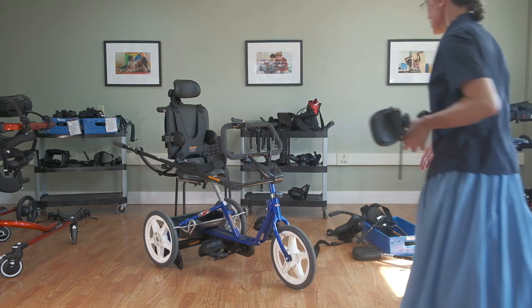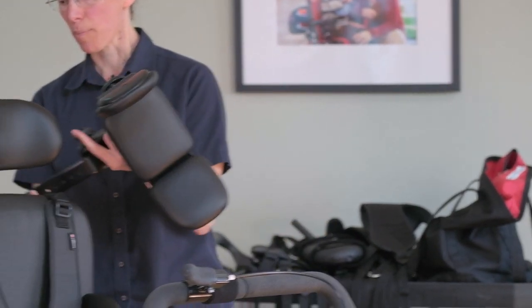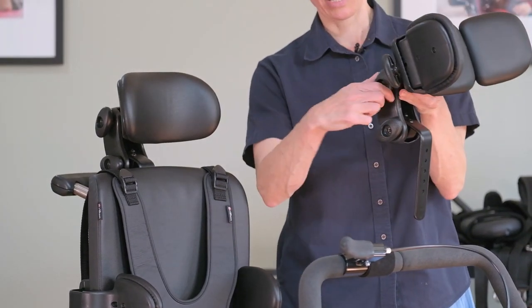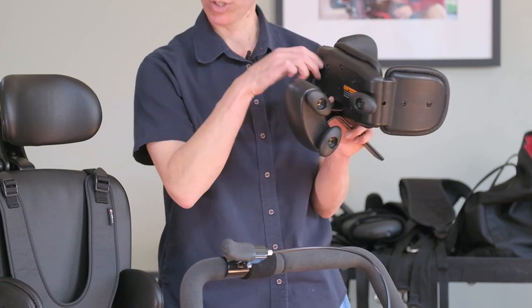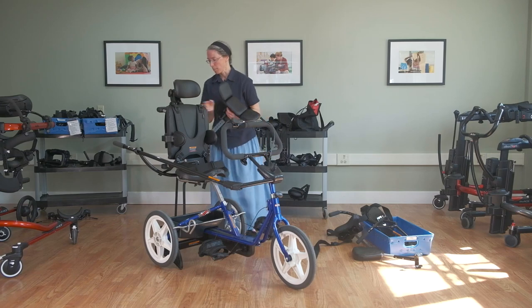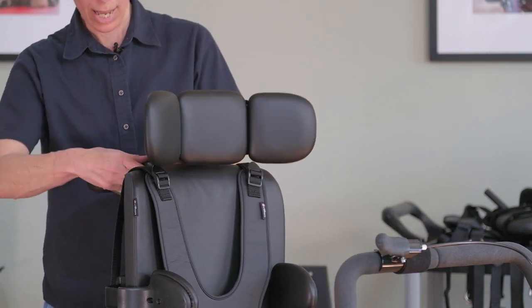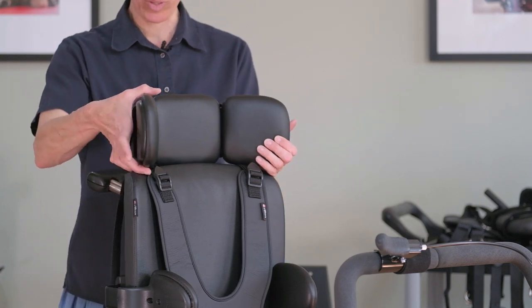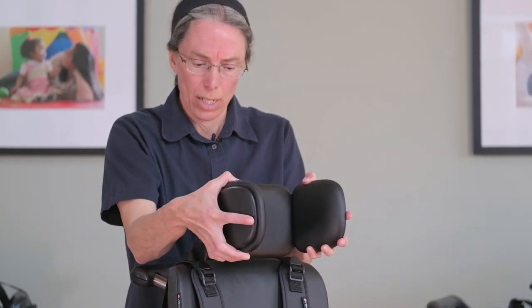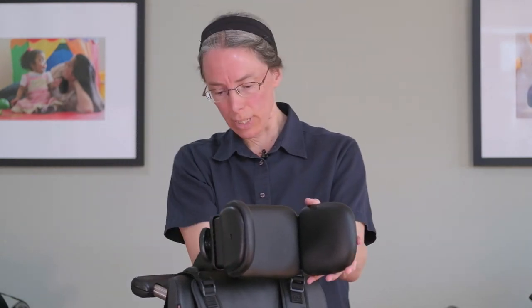Besides the curved contoured headrest, we also have the winged headrest. Each headrest has a white button at the back for height adjust and two knobs for more specific positioning; the winged headrest has two more knobs supporting the sides. You can have it in a fairly low position almost as a continuation of the backrest, or you can snug it up and angle it quite specifically to get support around the occiput to stabilize the head. You can also play with the height of the backrest to get it just where you want.